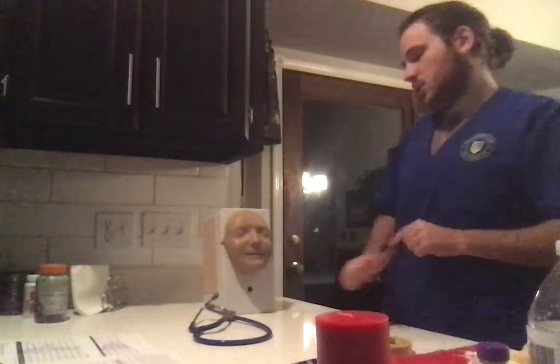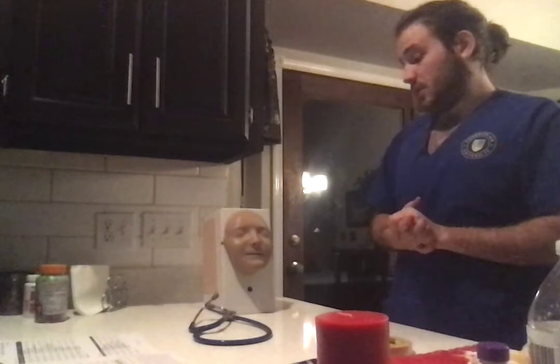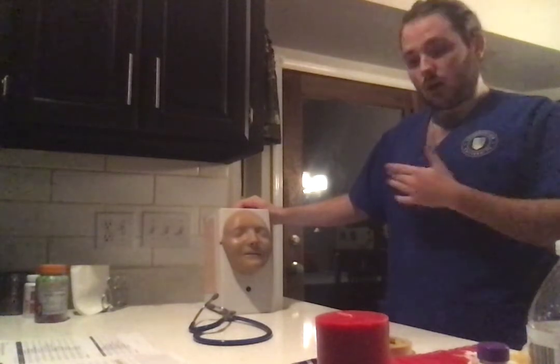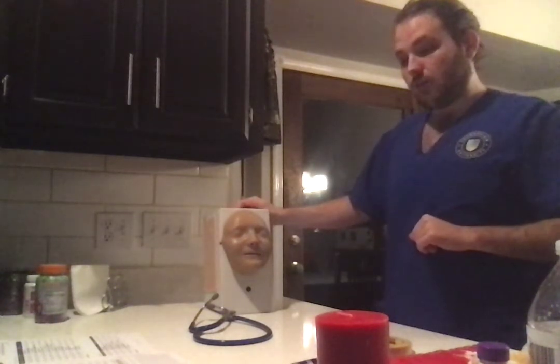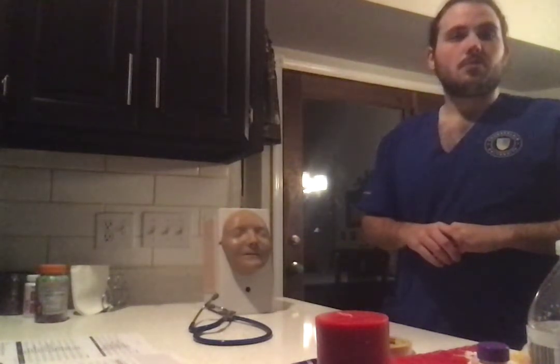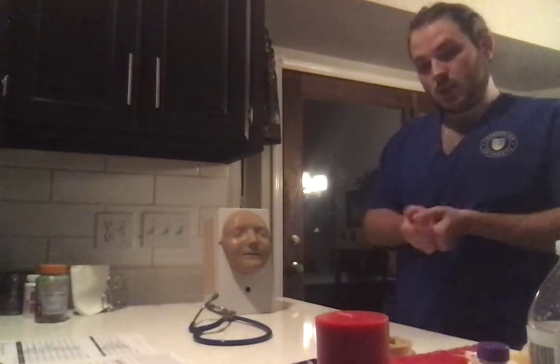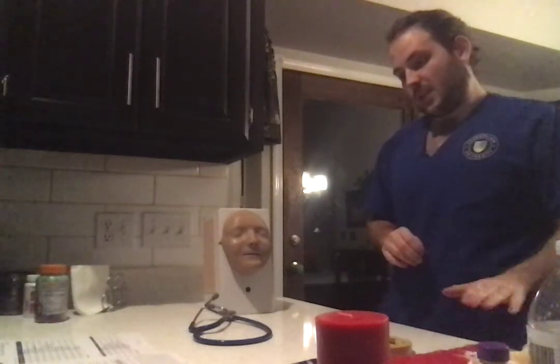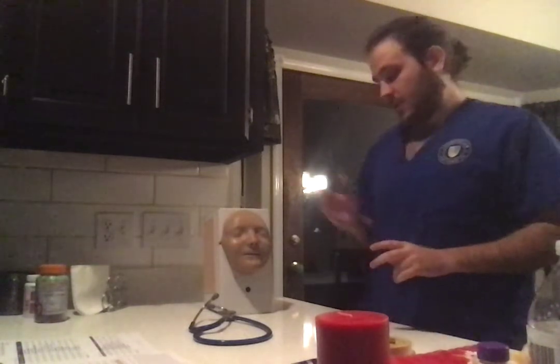As we enter the patient's room, we introduce ourselves and get two identifiers for Mr. Laerdal. His name and his birthday are most common. We would talk about the doctor's orders of placing or removing the NG tube. We would give the patient privacy, perform hand hygiene, and place our supplies on the bedside table, and then talk with Mr.